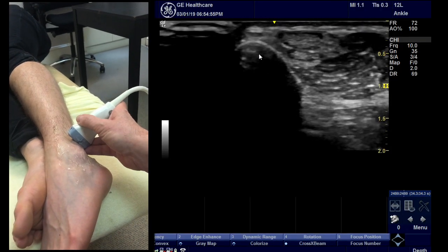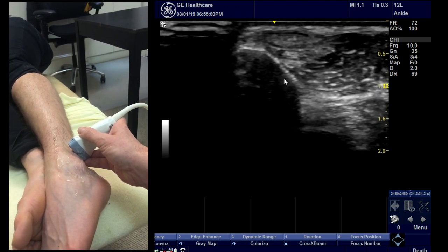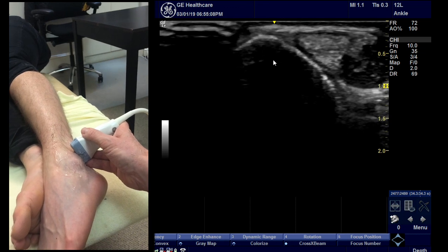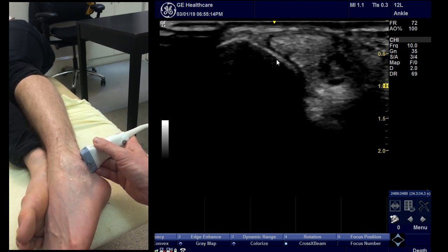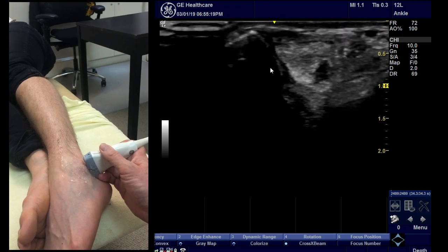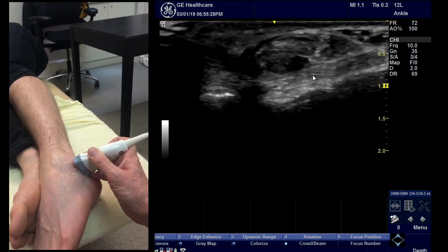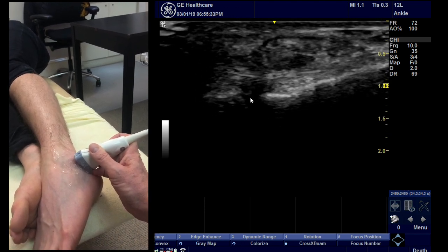Find the fibula and the peroneal tendons — posterior is the right-hand side of the screen. Follow the fibula down, sacrificing part of the screen to get the angle right as you come down. Follow the peroneal tendons down around the fibula and look for the point where the fibula disappears — that's where you get the long axis of the CFL ligament. You need to play with the angle a little bit, but that pretty much gives it to you. It also gives you the subtalar joint immediately beneath.